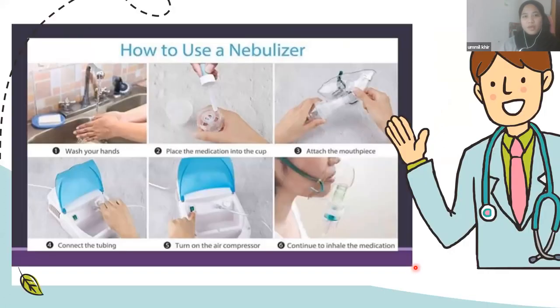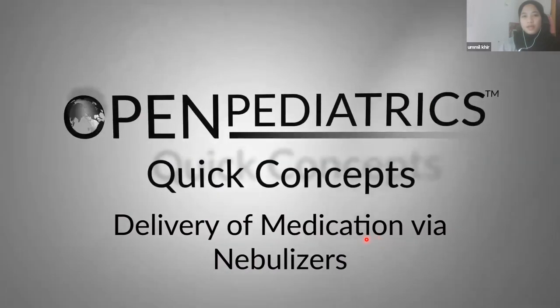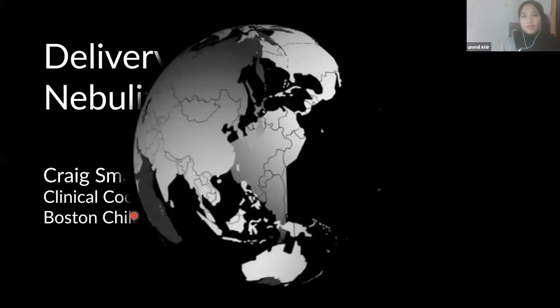Next. So how to use a nebulizer? Firstly, wash your hands and then place the medication into the cup. Then attach the mouthpiece or face mask, and then connect the tubing, turn on the air compressor, and then continue to inhale the medication. At the last step, we need to educate the patient how to inhale the medication. So we need to tell the patient to take a deep breath. Okay, next. So this is a video that explains more about this procedure.